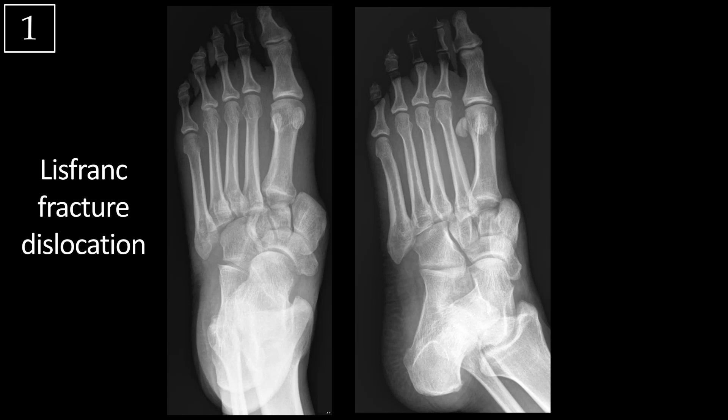In this case, all of the metatarsals — the first through the fifth — are displaced laterally. That's known as a homolateral Lisfranc fracture dislocation. However, you can also have a divergent injury where the second through fifth metatarsals are displaced laterally, but the first metatarsal is displaced medially. These can be subtle injuries if you're not looking out for them, so it's good to have a high index of suspicion for Lisfranc fracture dislocation anytime you're reading a foot x-ray in the setting of trauma.